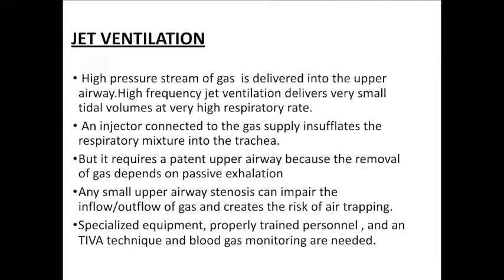Through this airway, continuous oxygen supply is given to the patient. The disadvantage is also the same. It is also not a secured airway. It can cause barotrauma as gas is delivered into the upper airway.